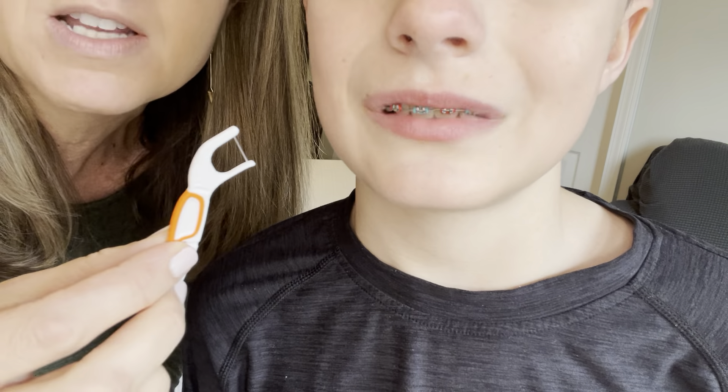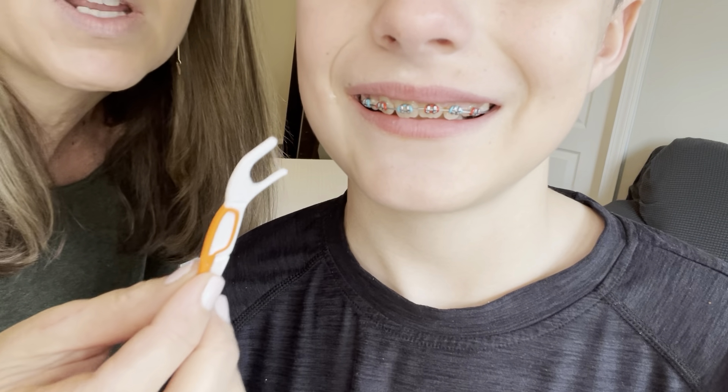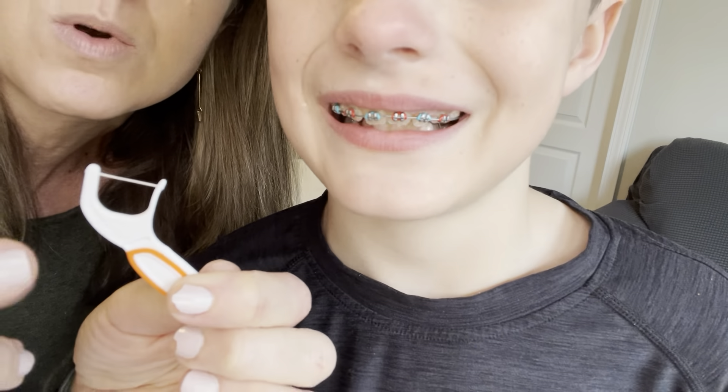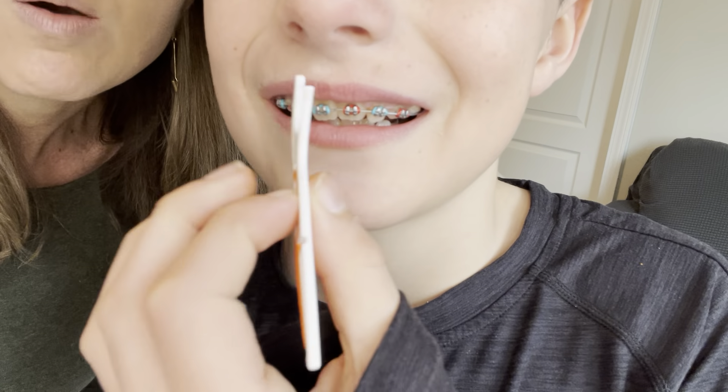I'm going to give you a demonstration. This brace wearer is going to give you a demonstration. The difference between these and the regular kind is just how they're contoured and the thickness of these. Go ahead and show us how it works with your braces.